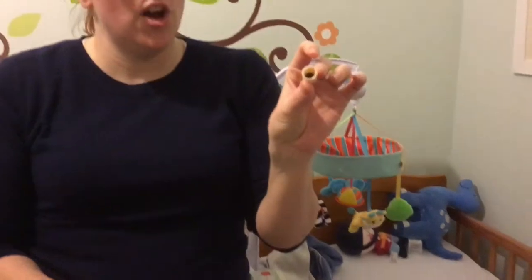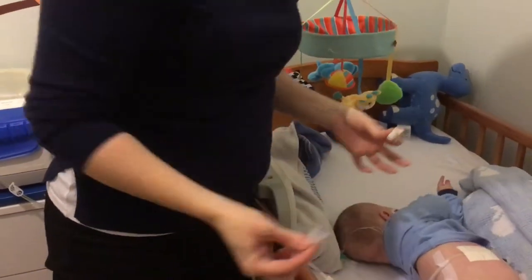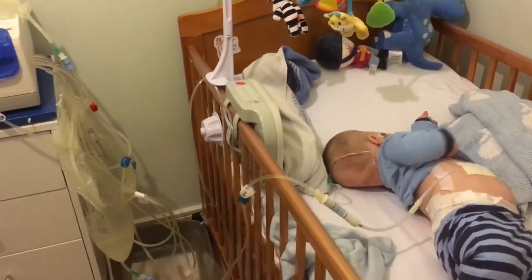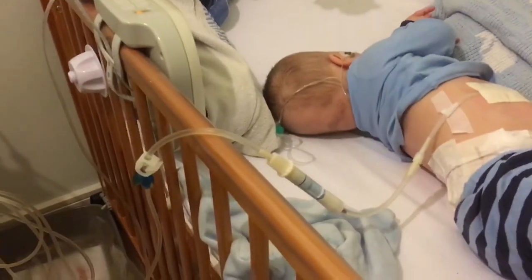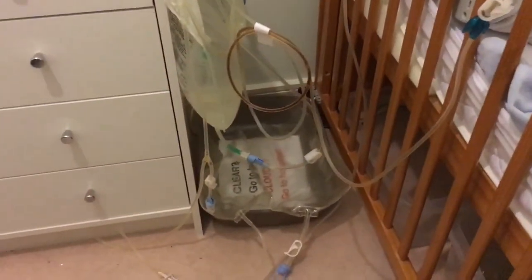The end of the cap is full of iodine, which usually means we get a little orange mess all over his bed — which is what's happened there. And then you press this and it's started. So it starts initial drain. You might see the iodine come shooting out of there — that shows that it started.